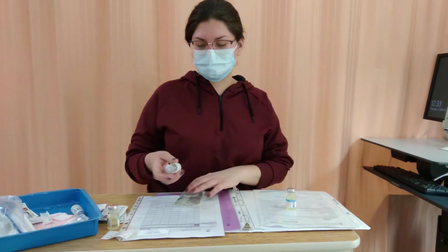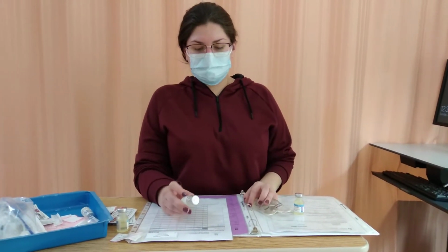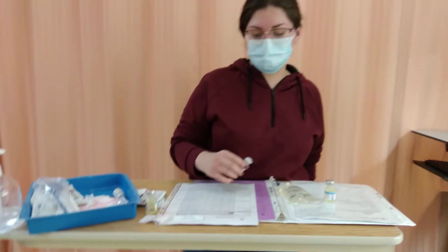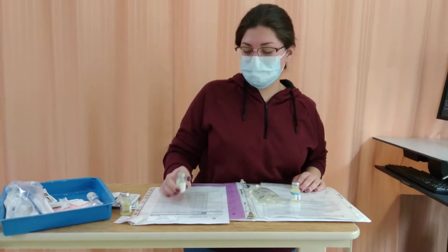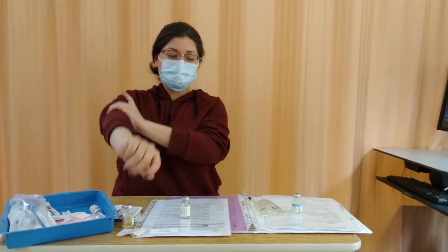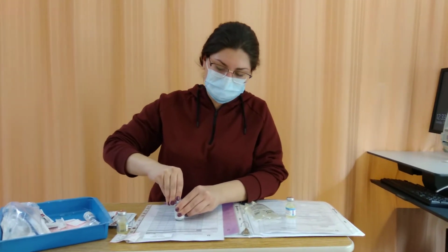Okay, we've basically already done our first check. So ampicillin, 1 gram every 4 hours. The time is now. They're allergic to shellfish. We're going to check that out when we go in. And the route is IV. So we're going to reconstitute our medication now.